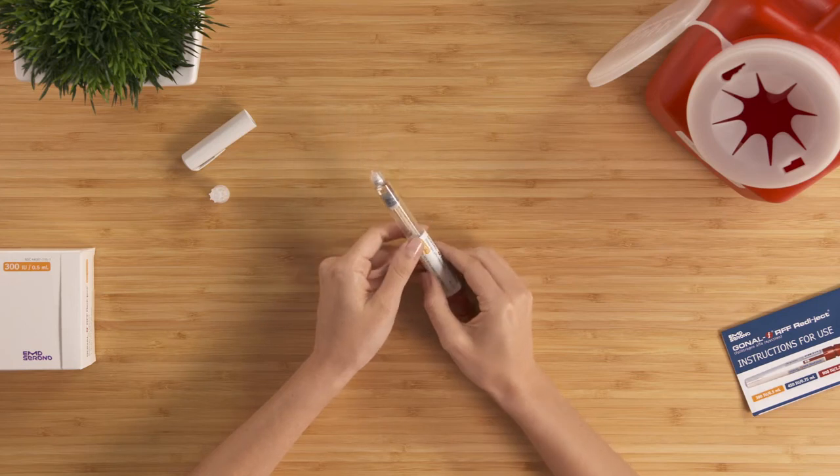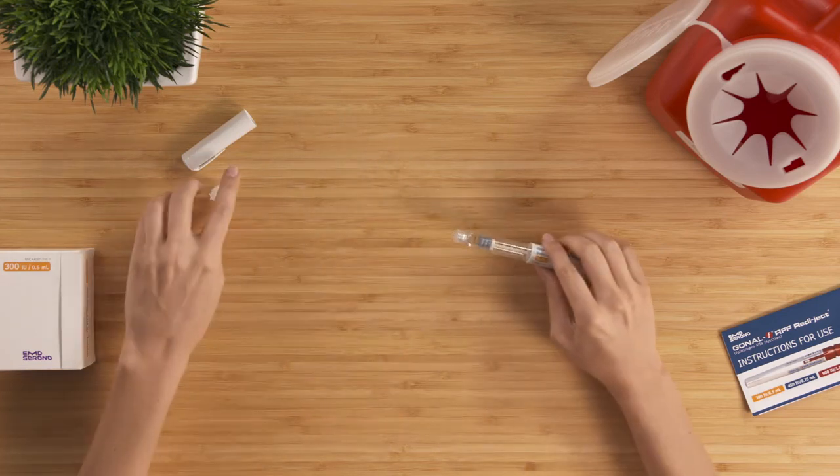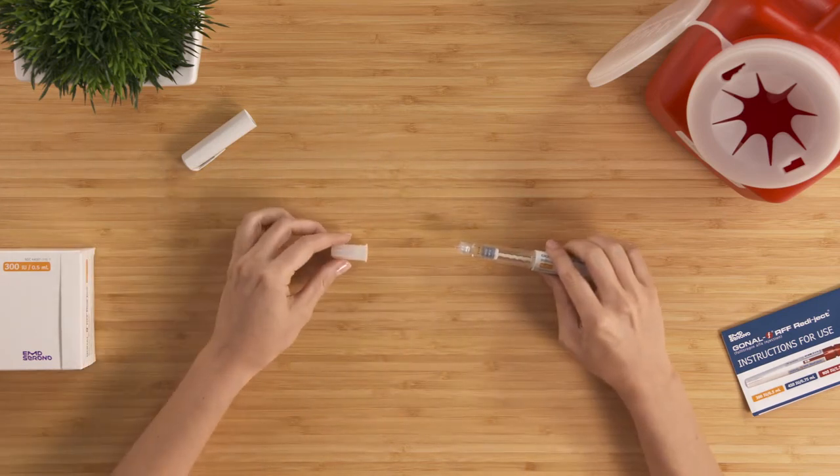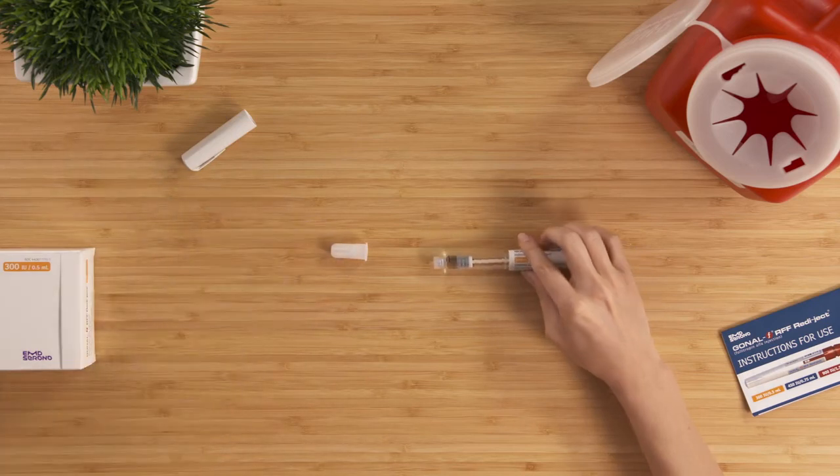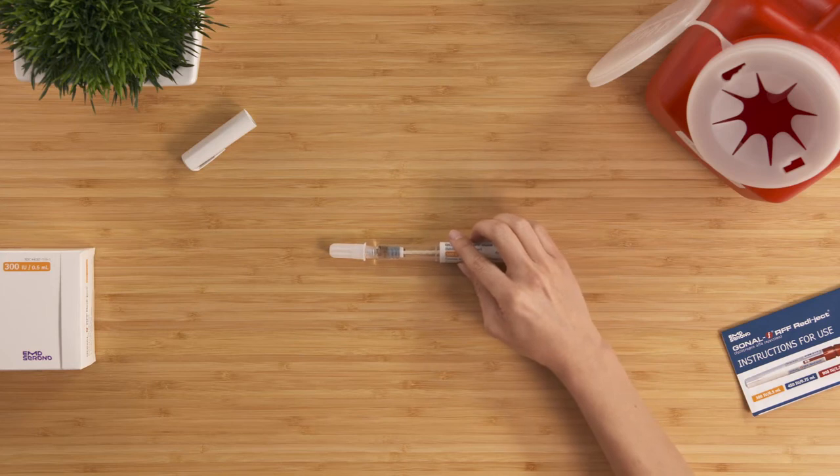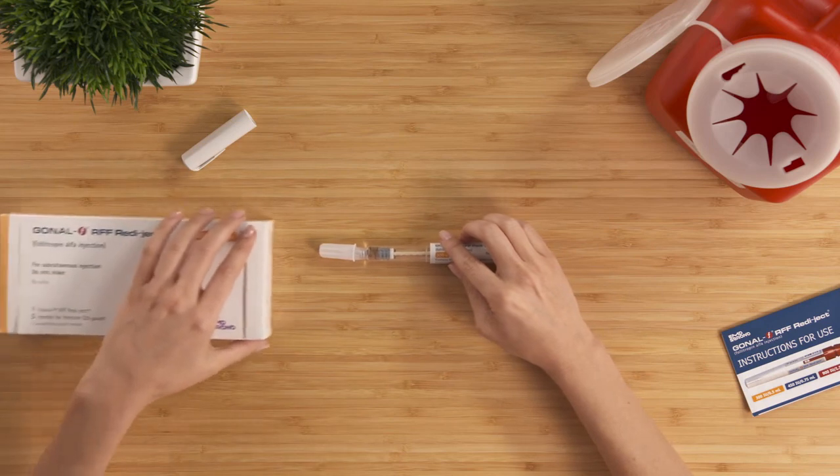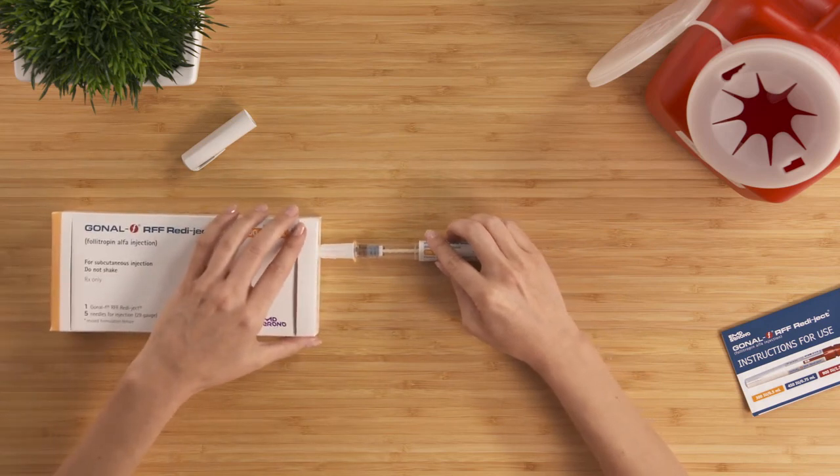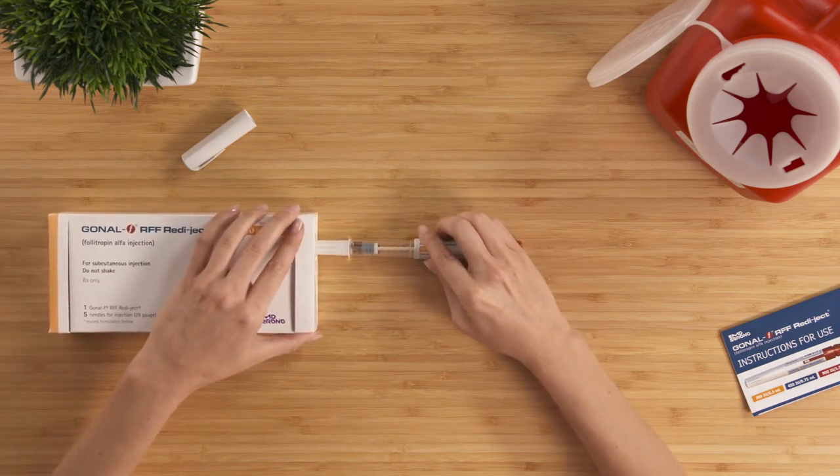I'll talk you through this step as I demonstrate. Lay the outer needle cap on its side on a flat surface. Then, hold the pen with the needle attached in one hand, and slip the needle into the outer needle cap without using your other hand. Push the capped needle against a firm, vertical surface, like the carton or a wall, until you hear a click.